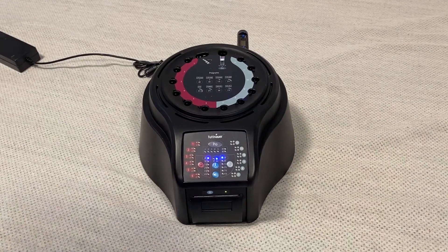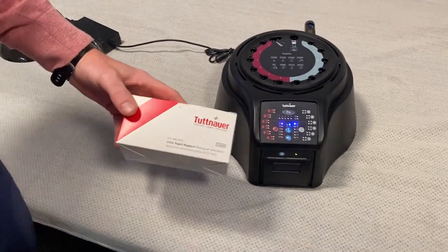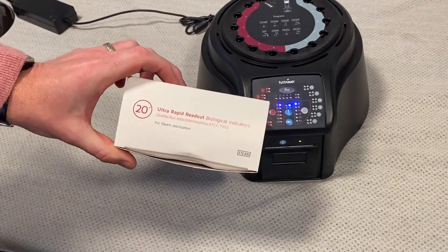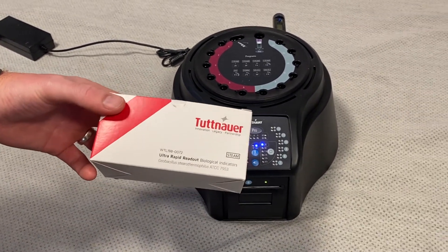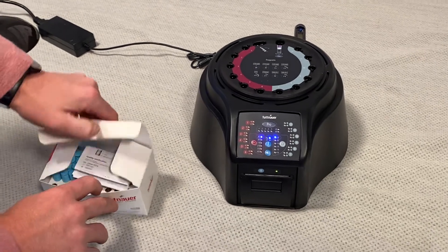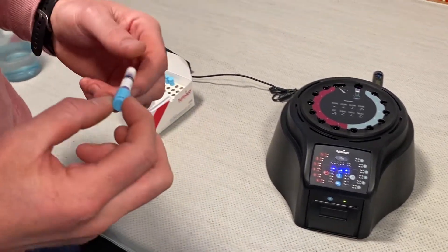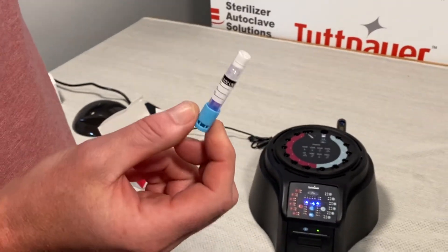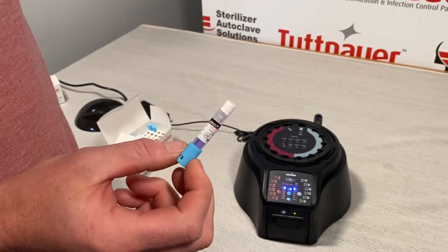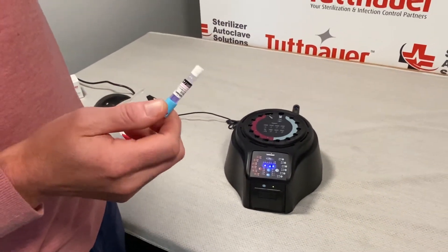Now that the auto reader is heated up to 60 degrees, we can go over how this works. We're going to be using a 20-minute ultra-rapid readout biological indicator. These indicators are super simple to use — you're going to take your indicator and place it in your steam sterilization load. Once that is finished sterilizing, we're going to pull the indicator out and it's now ready for testing.